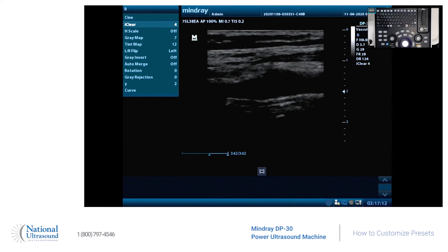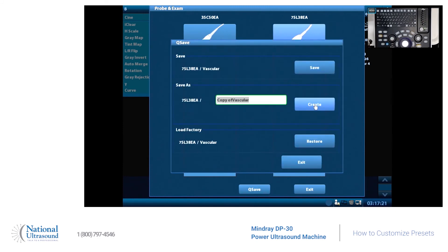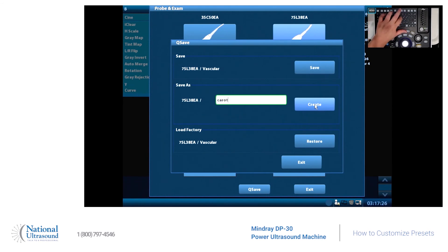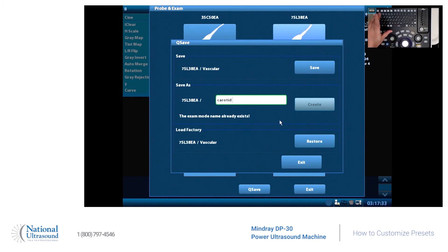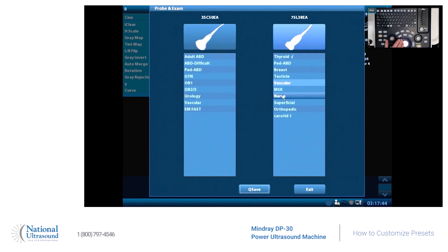We've changed out a few settings — how do we save this? We're going to hit the probe button one more time, then hit Q. We're going to call it 'Carotid 1.' Select create — there we go, and it is saved. There's Carotid 1. And that is how you add a customized preset using the Mindray DP-30.